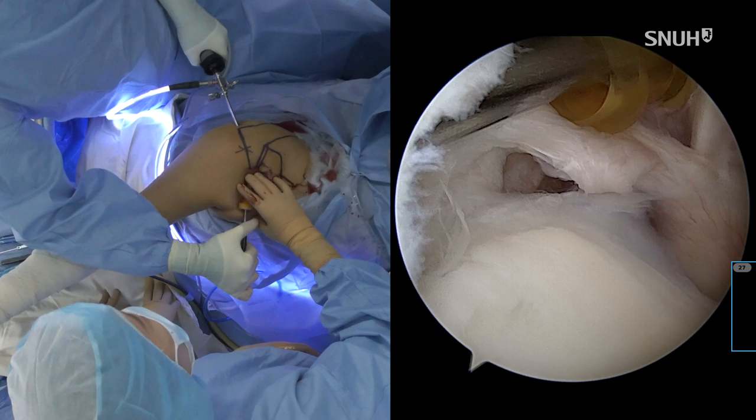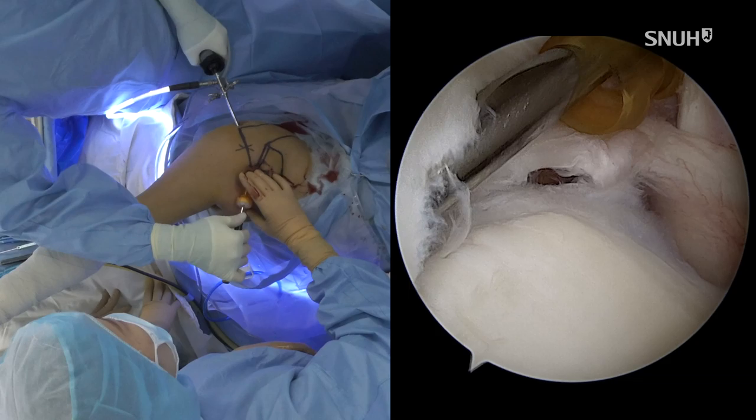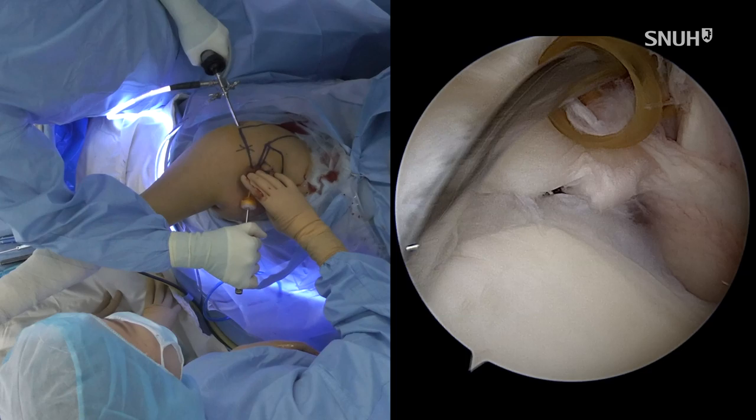I can palpate the suprascapular notch area with this probe, so I can feel nothing is interrupting over there.